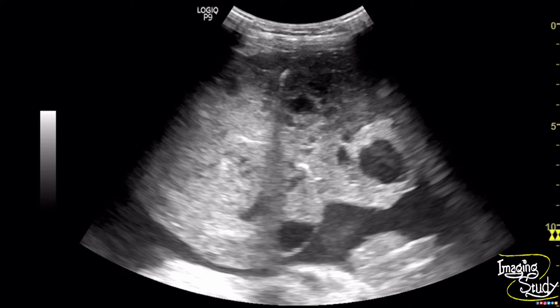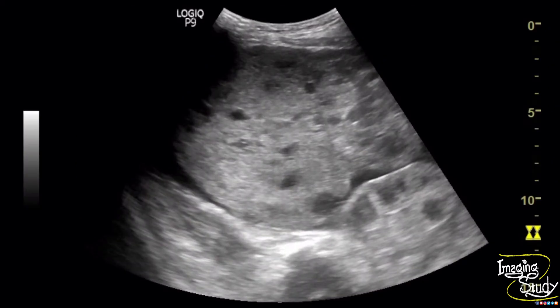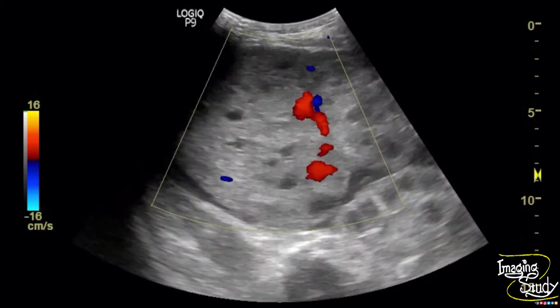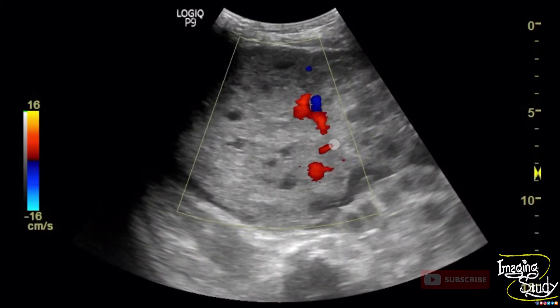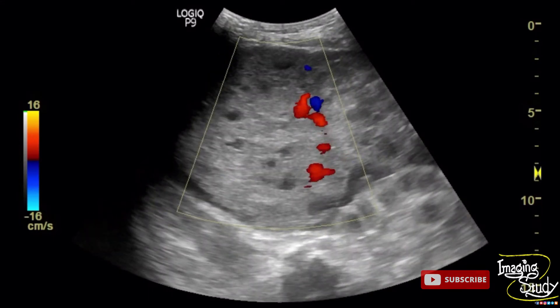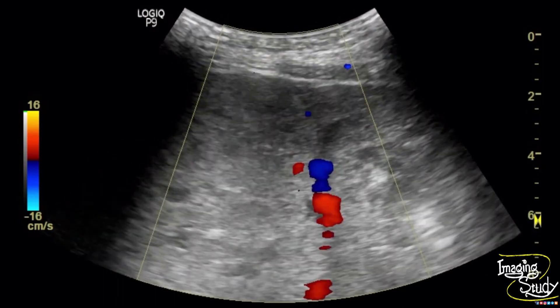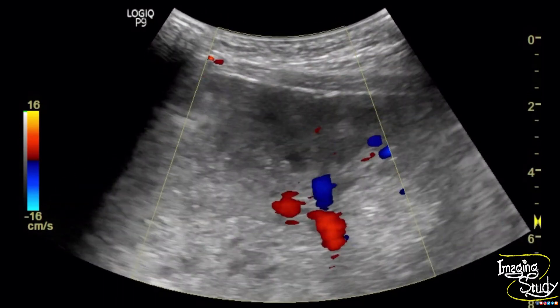Now let's see what we get on color Doppler. Usually teratoma is a benign condition and should not show any significant vascularity. When we apply color Doppler, we can see a huge vascular flow within the lesion — a very good amount of vascularity. The PRF was high, so small vessels are not visible here; only the larger vessels are visualized from this view.